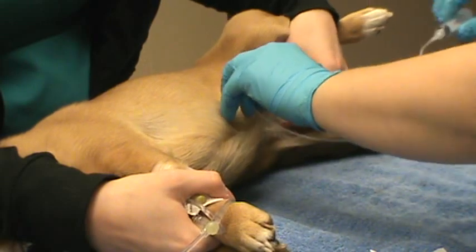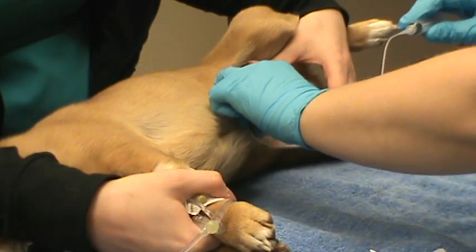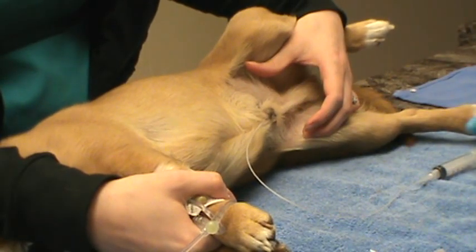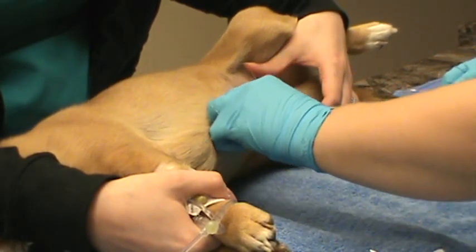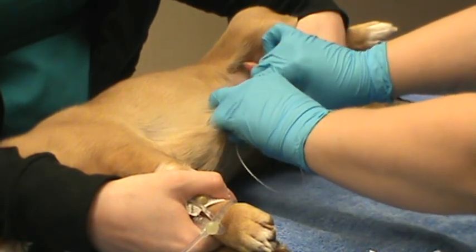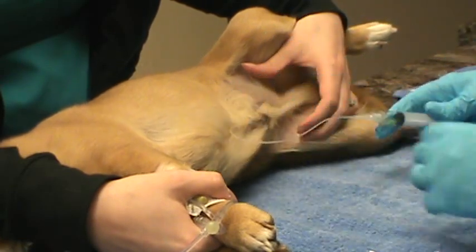The length should be right about here, so I'm going to keep going a little bit more. It's going just a little bit further — and draw it back. It felt like it slipped in there and we're in the bladder.